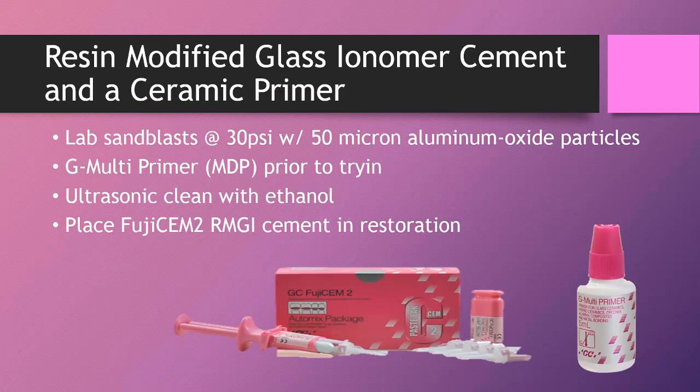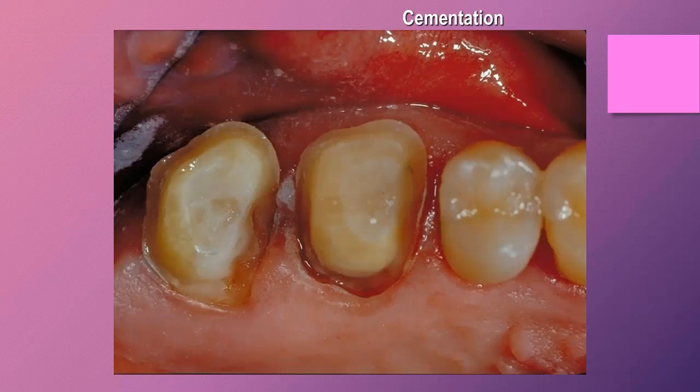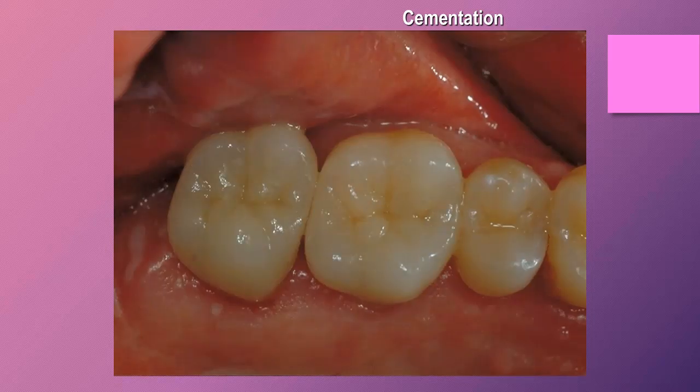So I throw a couple slides in that you have as far as review if you go back and get a handout that I've basically given you a cookie cutter approach of how you might implement a system like this. So if I have a case in such a fashion where I'm under the gum line, hard to isolate, there's no way you get a rubber dam on there. If you try to use resin here, you're apt for failure in the future because it's going to fail right along that margin where you cannot stop sulcular fluids. And so this is a great place to implement one of the original bioactive cements being a resin-modified glass ionomer, and adding in maybe a ceramic primer. So here we have 2 zirconia restorations being adapted to the tooth with some traditional cements.